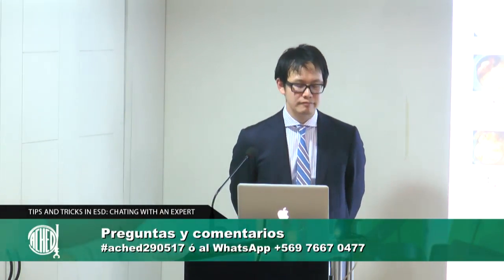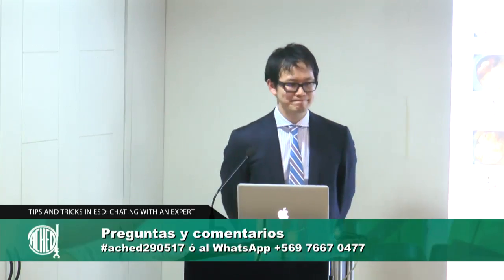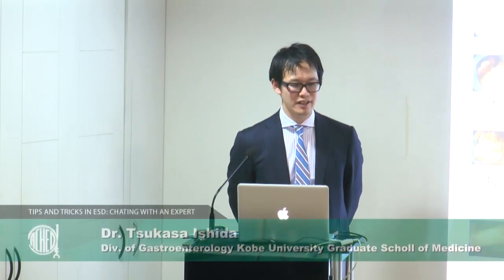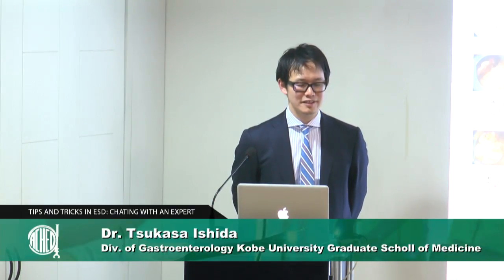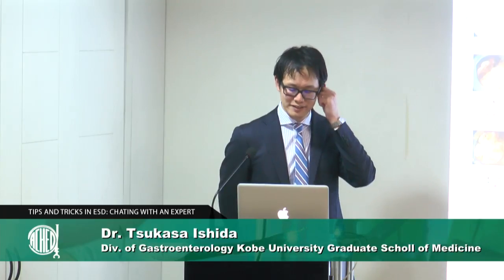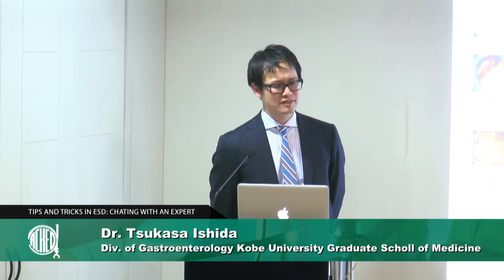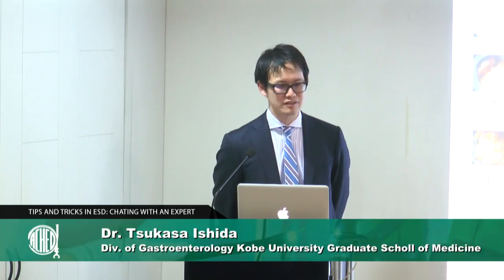Just a question. In your experience in Japan, which cases are now sent to EMR? Is there any case that you prefer to use EMR instead of ESD? Less than 2 centimeters is usually resected by EMR procedure. So it's size. The one point is the size. But even if it is less than 2 centimeters, flat and depressed regions we usually resect by hybrid ESD.